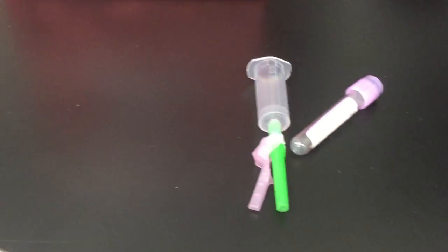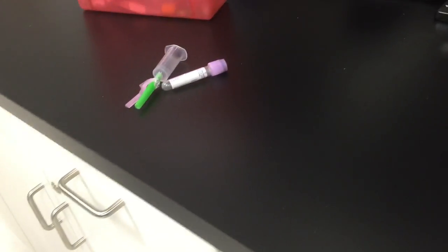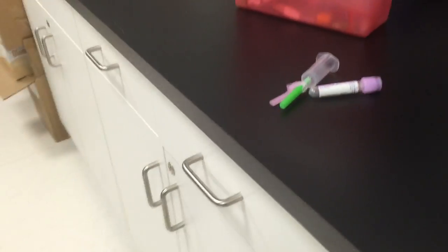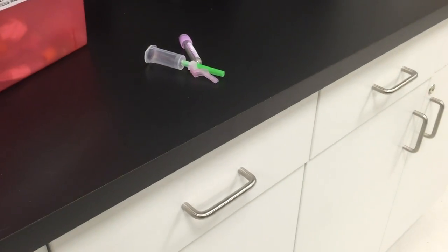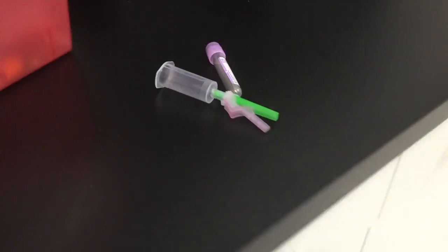Now we're going to go to our needle safety kit. We're going to put this in a biohazard trash bag first, and then we're going to go to our needle safety. You're going to change your gloves if you haven't already. This is during regular venipuncture procedures that you'll be handling this needle.